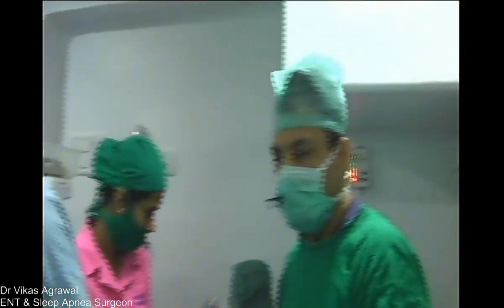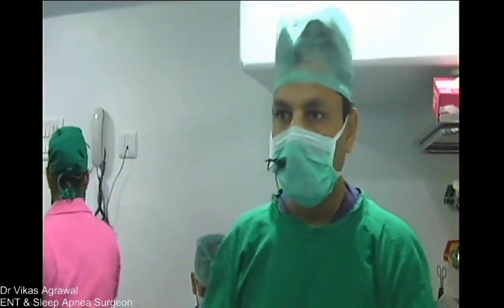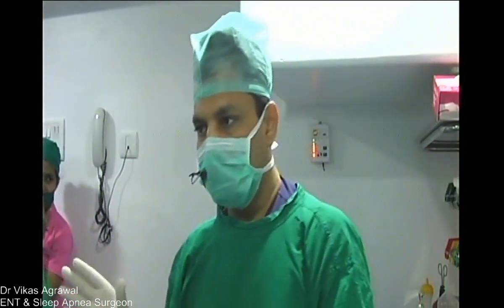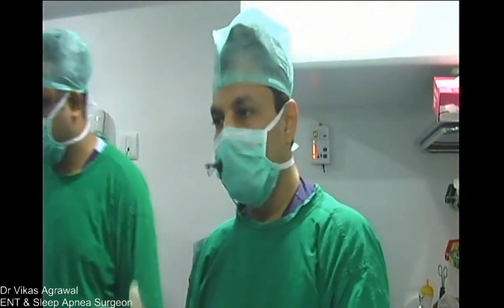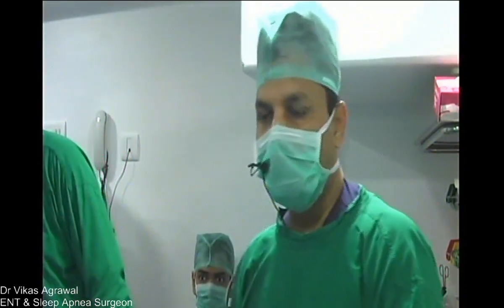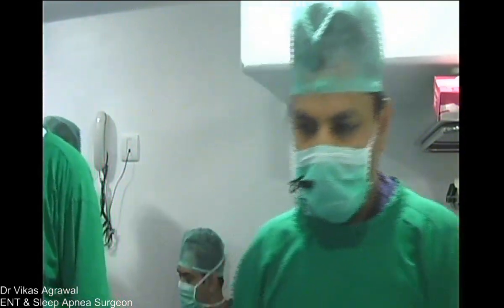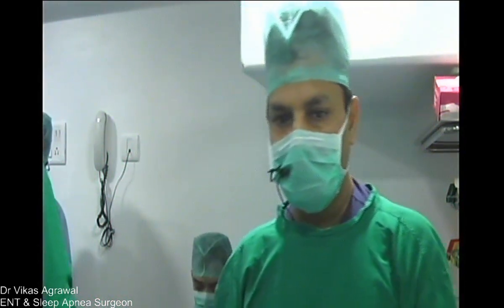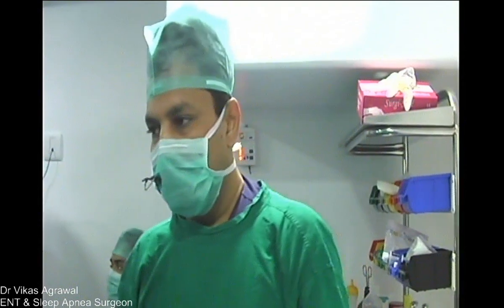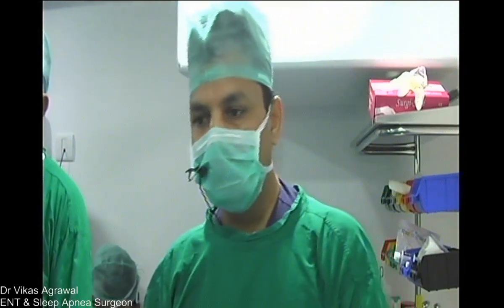Yeah. So if you have any questions, do you have any more questions over there? None right now. None on the group. So I think it will take around 5 to 7 minutes for him to extubate, and another 15-20 minutes before we intubate the other patient. And I'll try to show you the drug-induced sleep endoscopy. Abhi toh time hai na. So we'll definitely take questions, but if required, we can possibly have another talk in that time, and maybe I can show you multiple drug-induced sleep endoscopies, if that's what you think is going to excite you more.